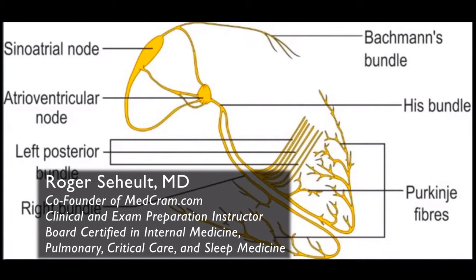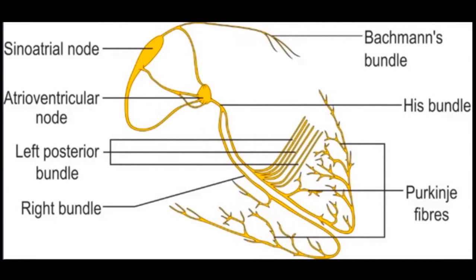We're going to get right to where we left off with the EKG. We're going to talk about the P wave, and actually all the waves, but we'll start with the P wave first. As we discussed, the P wave is the first wave, and it starts off in the sinoatrial node, up here in the SA node, which has the most automaticity.